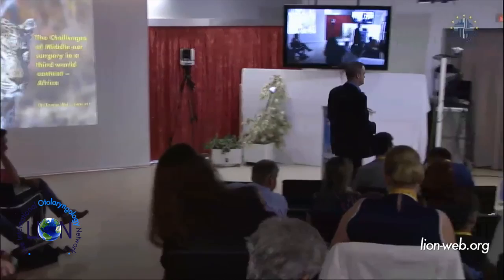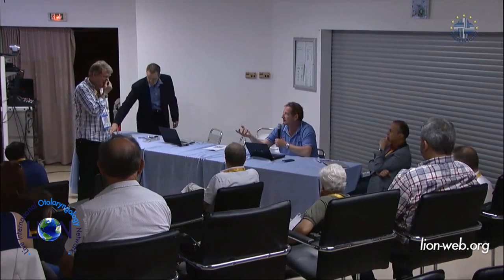Back to Wilco. I think a major advantage of what Robert is showing us is that it's another trick or tool in the toolbox that we've got. When you run into trouble, you can use it. Because what if you don't have a stable superstructure? You do need a malleus. If there's nothing in here, then the neomalleus is fantastic; otherwise you wouldn't be able to do anything. Of course, you would need to use the vein graft if it's a fixed stapes. But if it's just a footplate, the neomalleus is a good start to get some structure on top of it. So it works very nicely, yeah.